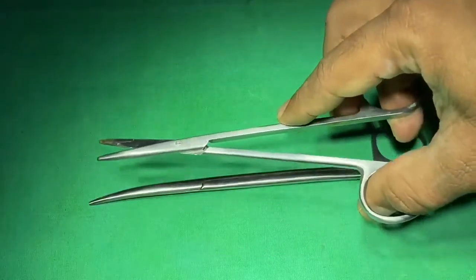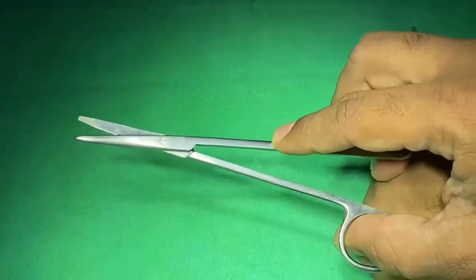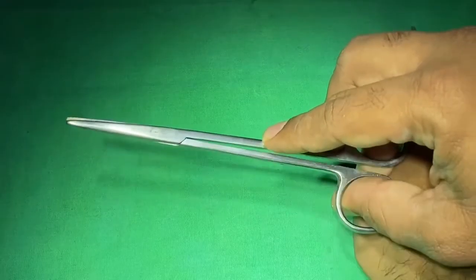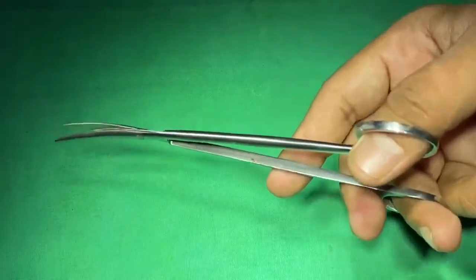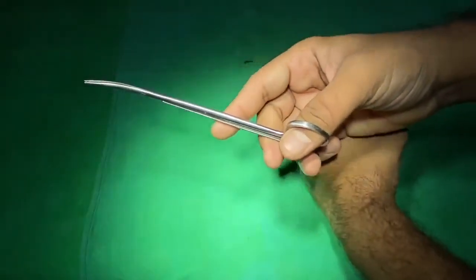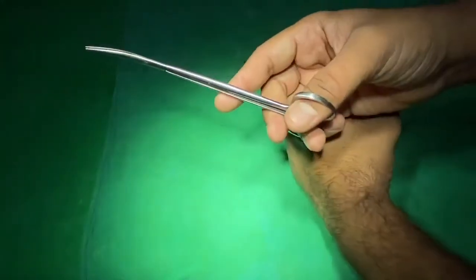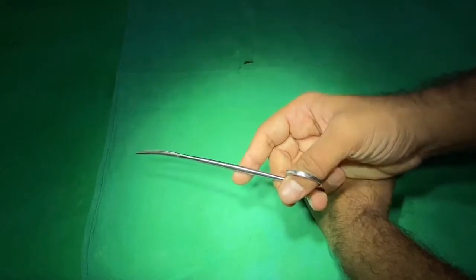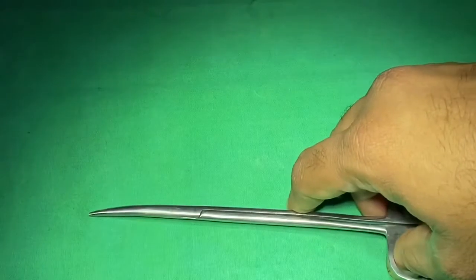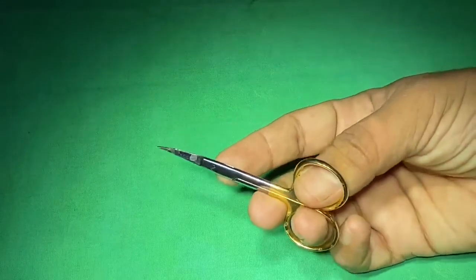This is a straight scissor used to cut suture thread and somewhat harder structures than tissue. This is the method of handling scissors — we use a tripod grip where three fingers are used to handle the instrument. When cutting, the operating hand has to be rested on the other hand as a supporting hand to cut the suture or handle the tissue. This is another small scissor.